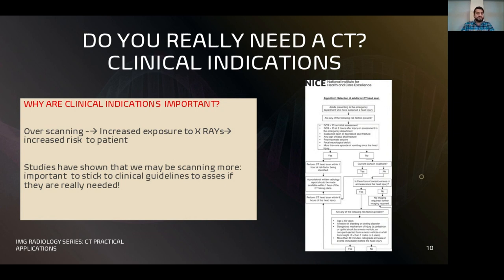And there are some patients who have certain diseases or disorders, or comorbidities, which require interval CT scans. For example, patients who have ITP or bleeding disorders may need to have interval CT scans, and more importantly, if they present with certain symptoms, like headaches. You're thinking to yourself, is there a potential bleed? Or, for example, patients who are on blood thinning medications and have had a particular fall would most likely need a CT scan of the head. If you're considering any kind of internal bleeding, they would need a CT scan.